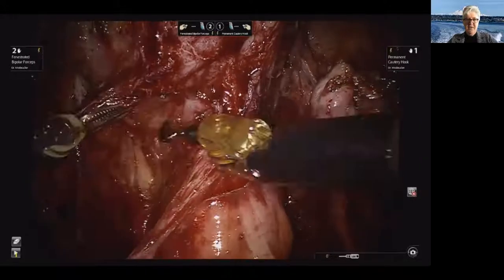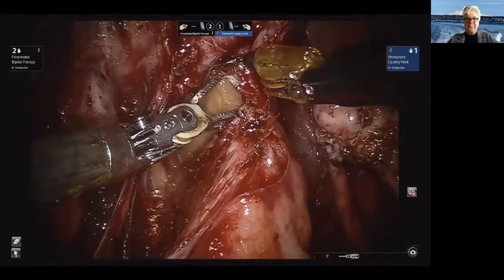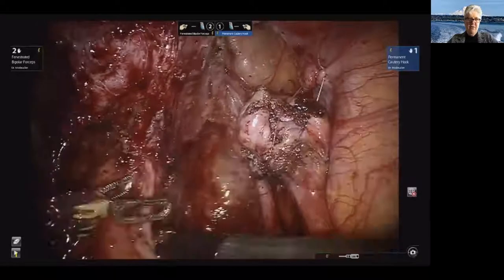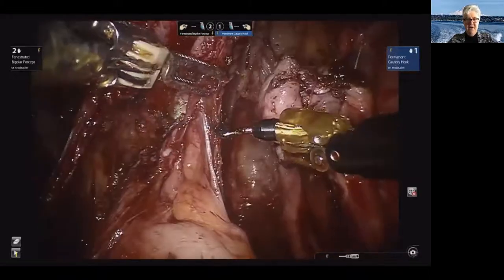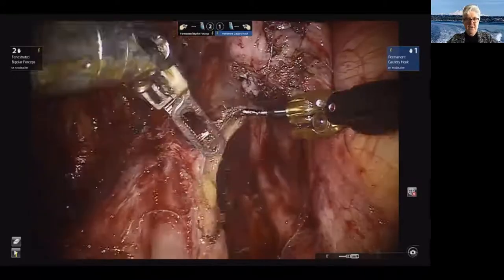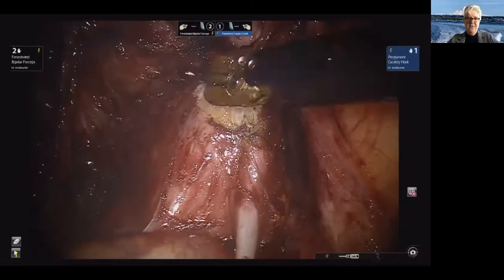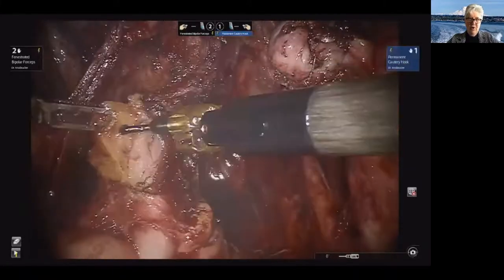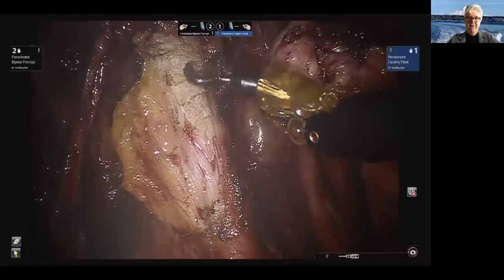Most of the time you can get around these lesions, even if they're quite deep in the vagina, by going down the pararectal spaces and into the rectovaginal space, and then you can get around the bottom end of them. This is shaving off some of the peritoneum of the cul-de-sac. You can do these cases with or without an EEA in the rectum — sometimes it's just as easy to do it without. The fat is usually on the sides; the bowel wall will be more in the midline. Use monopolar cutting current for the bowel wall itself, but you can use coag on the fat as it has a lot more vessels.